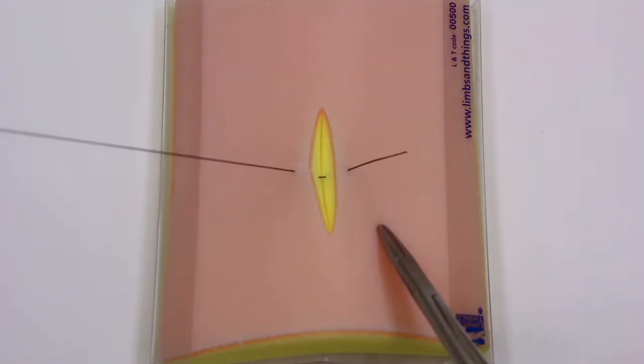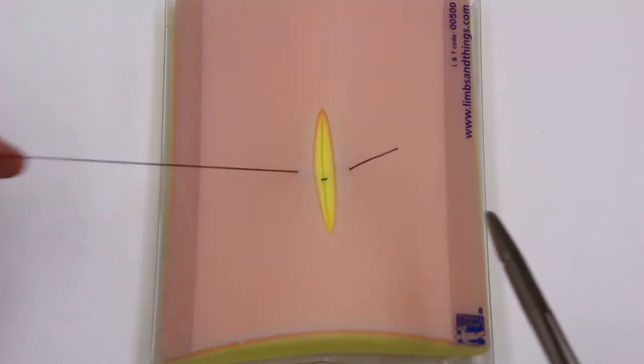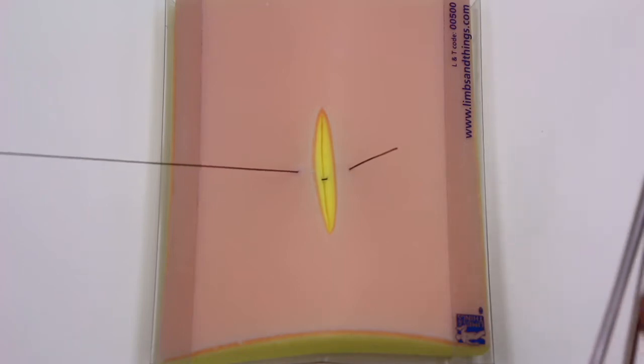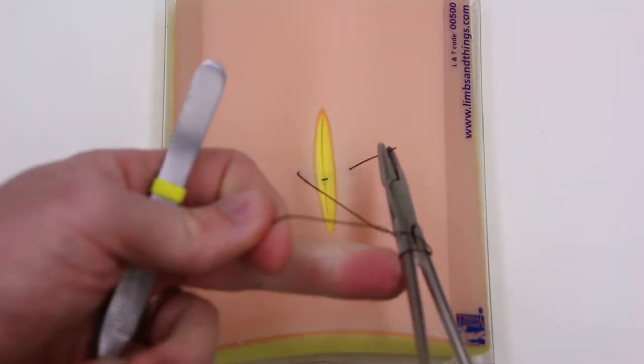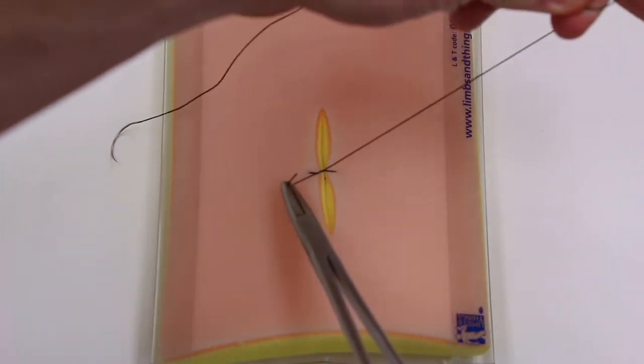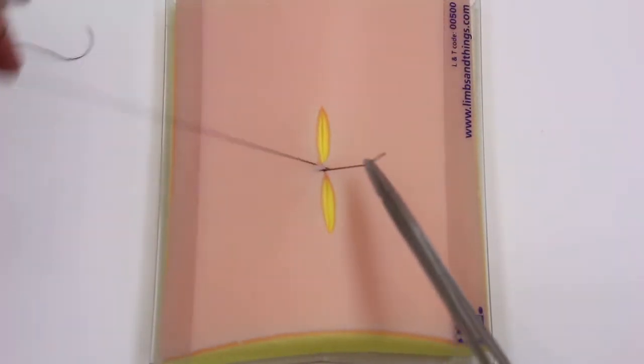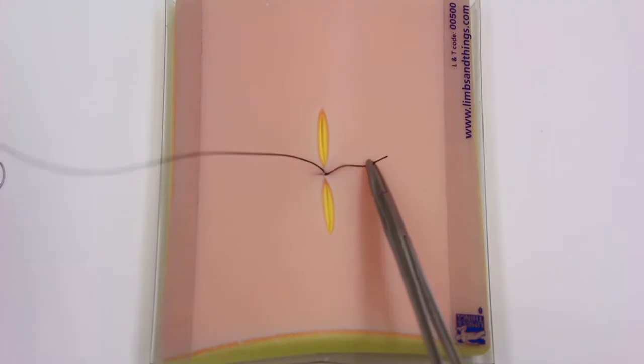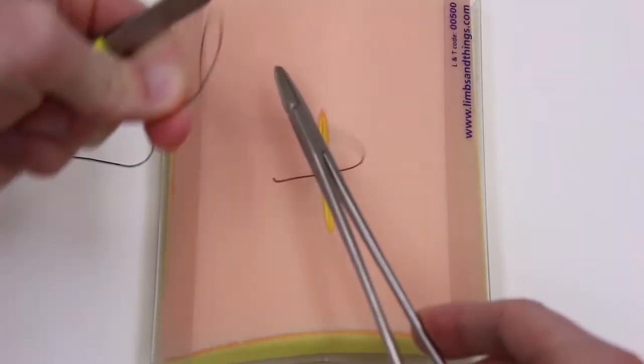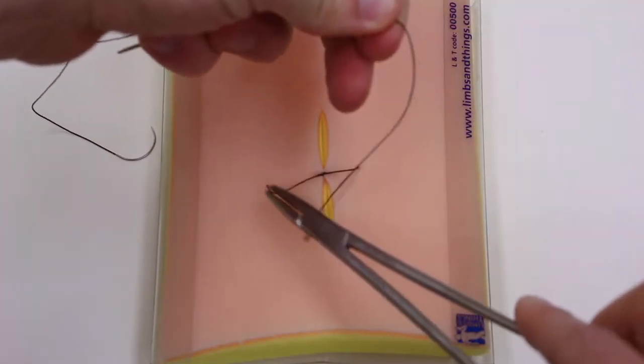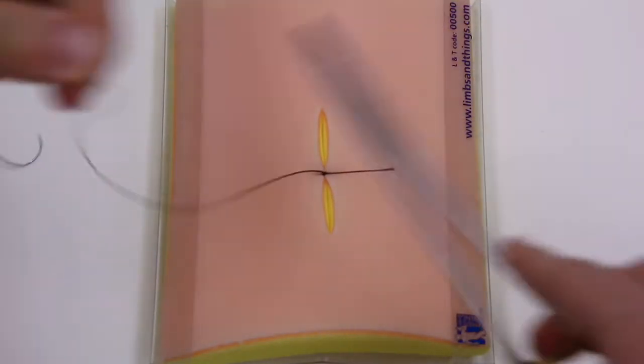Pulling taut, and then it's just the same instrument tie we went over before. So the first is two wraps. You'll notice this first is under a bit of tension, so I'll do that reverse move that I showed. And then one wrap, one wrap, wrap once.